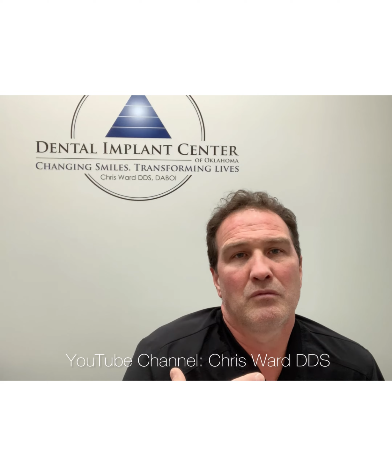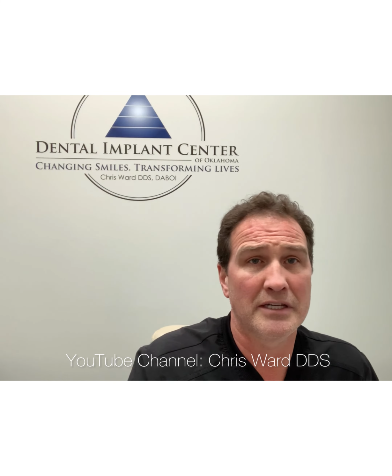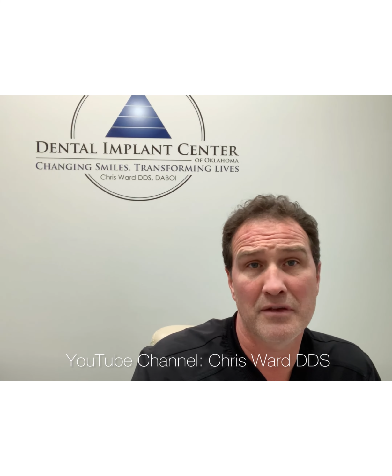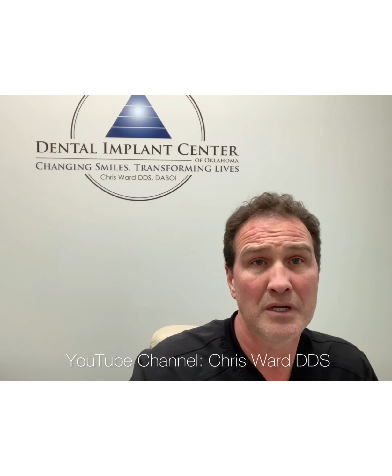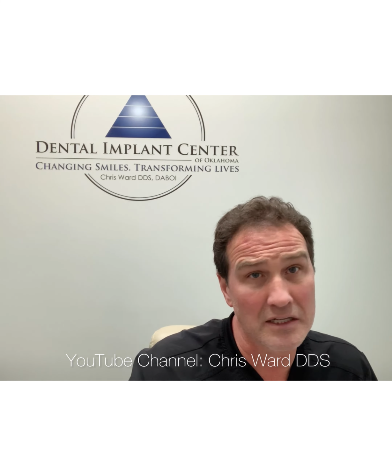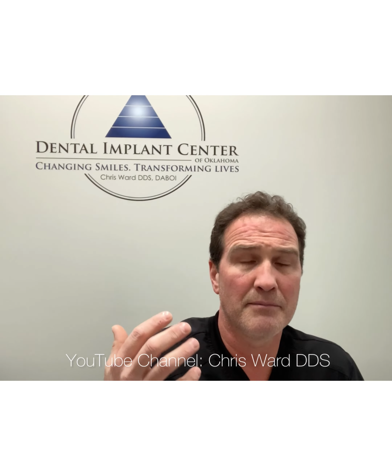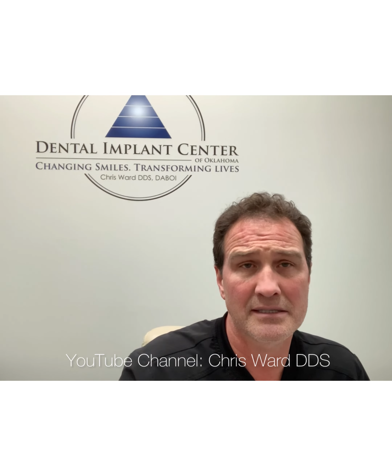The downside for us when we see that is most of the time they end up getting loose, or they just unscrew or fall out. There's not a lot of surface area there for the bone to physically grow to. And it can be 10 years later and I'm going into a situation where I'm literally just unscrewing the implant. The bone never grew to it. And so the mini implants have an indication, but typically it's a temporary indication in our practice.